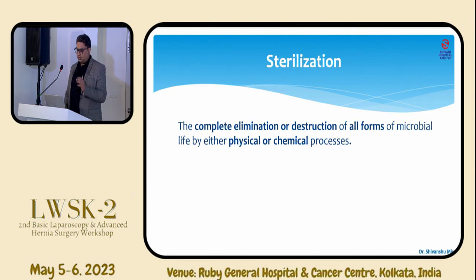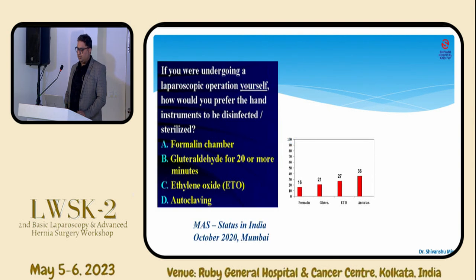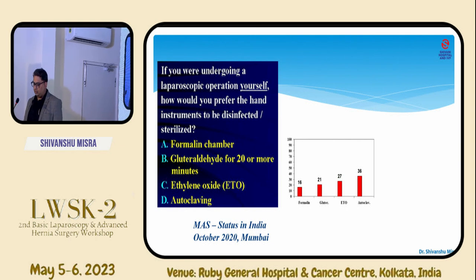So what is sterilization? It's the complete elimination or destruction of all forms of microbial life by either a physical or chemical process, okay? And when the survey was conducted, asking what people would choose if they were to undergo laparoscopic surgery themselves, most of them opted for an autoclave, then a few of them ETO, and very few had formaldehyde or glutaraldehyde sterilization.